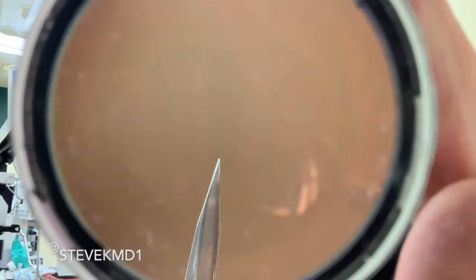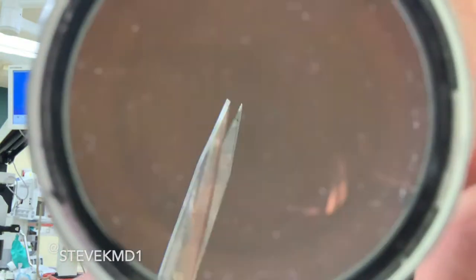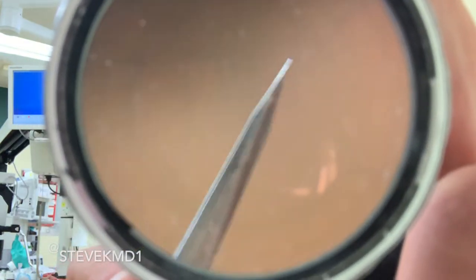I almost forgot — I wanted to go over scissors. When we are doing eye surgery, there are two main types used during anterior segment surgery. The first is called a Westcott scissor. The tips can be pointed — sharp Westcotts — or more blunt or rounded depending on what you're cutting.